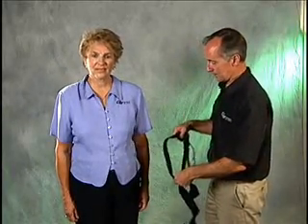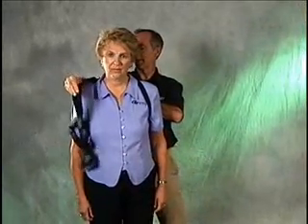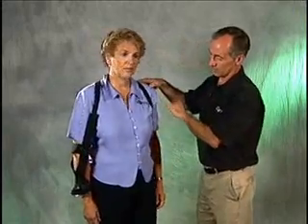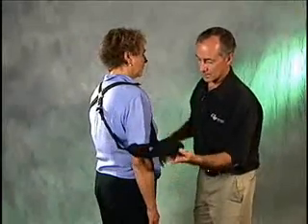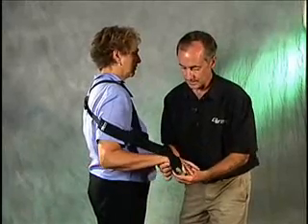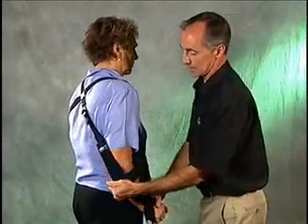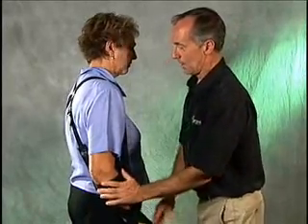In donning the sling, have the client put their uninvolved arm through the loop of the shoulder harness, and lay the sling across the back. Then before you place the elbow in the sling, take the flaccid hand and place it in the handpiece of the Gibmore Sling. Then allow the arm to hang down by the side and pull the elbow strap around the elbow.